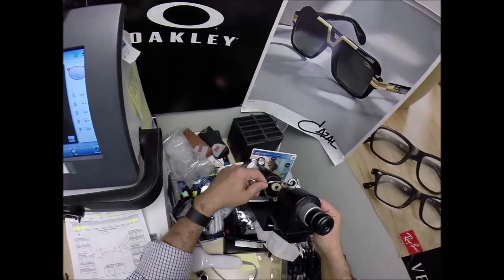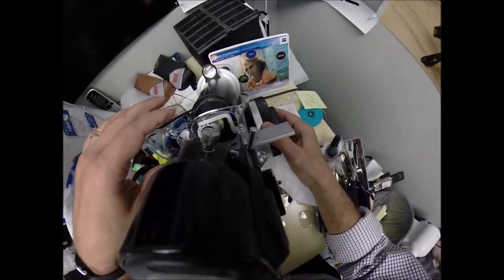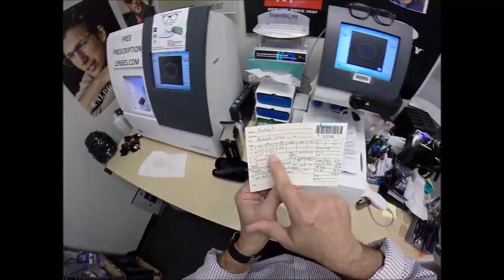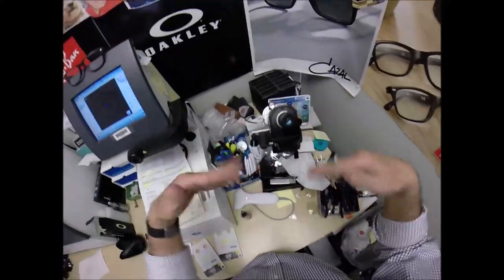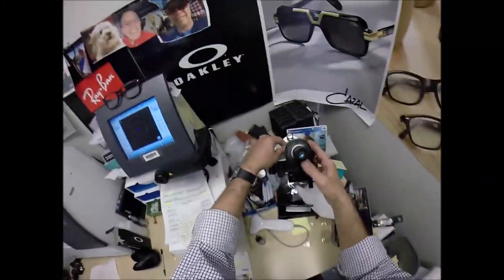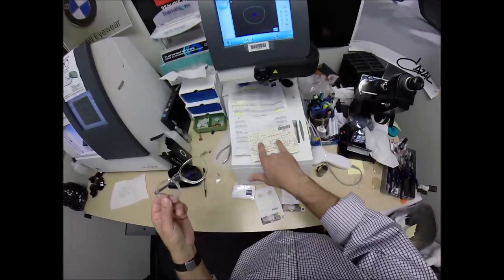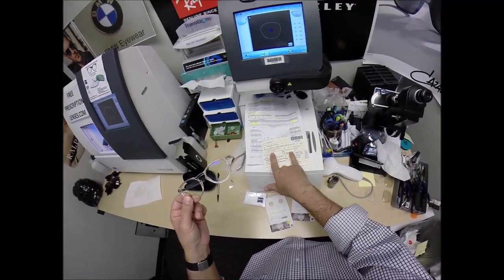Place the frame into the lensometer. Read the power. And I'm actually getting the same power all over at minus one. This is known as final inspection. I'm doing an inspection to make sure the lenses are cut to the exact power they're supposed to be.